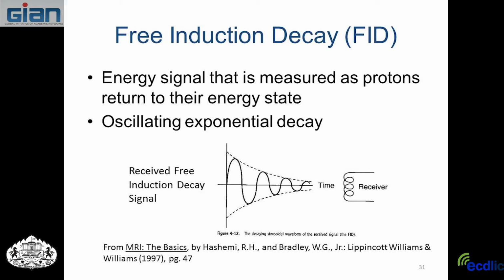That's going to be important when we go to recreate our images, because remember that Fourier transform we talked about yesterday that oscillates as a function of sines and cosines? That's what our signal is going to be composed of. It's going to be a spatial oscillation, and we're going to use that fact to reconstruct our data into an image. Are you guys all following okay? I know it's a little tricky. I just want to give you the basic idea of what's going on here.